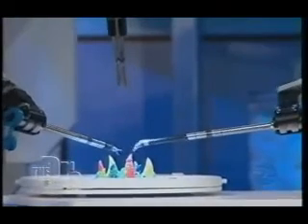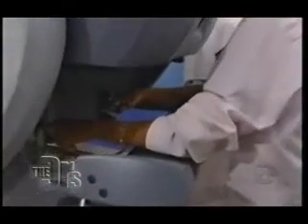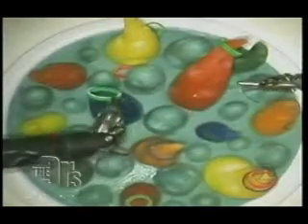Different from regular laparoscopy, where the instruments are usually a little bit more stiff, this has such a range of motion that you can feel and that you can move with. The 3D, really having depth perception. You can see and visualize so much better.